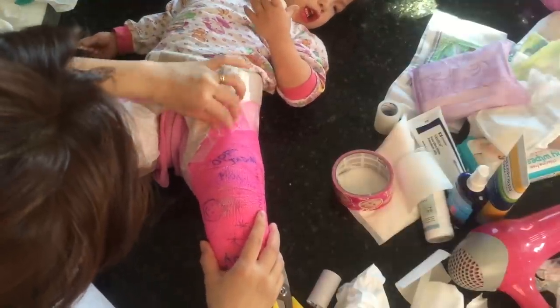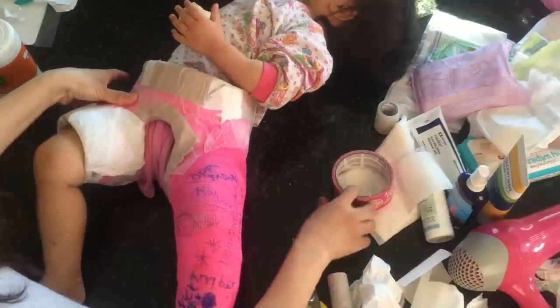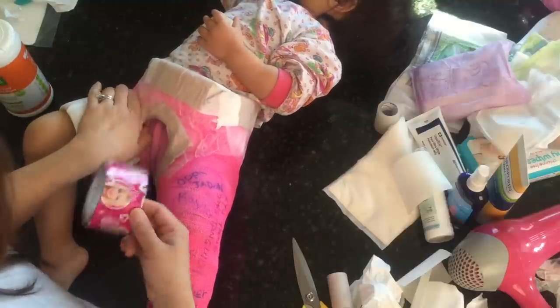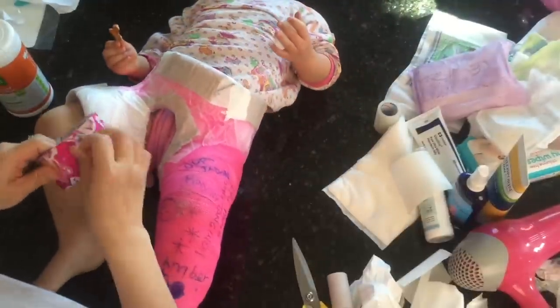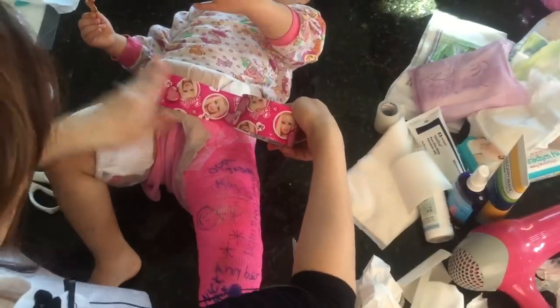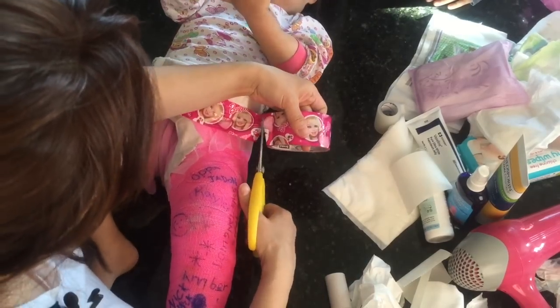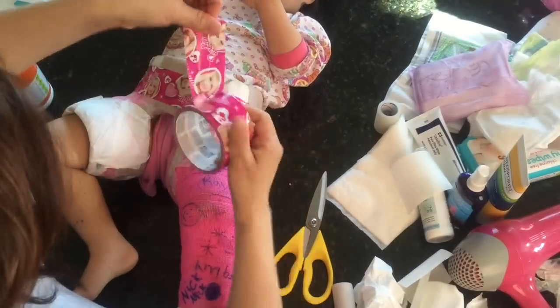Touch it with your hand to see if anything isn't sticking properly. The hospital tape doesn't stick super well on its own, so if she's sleeping and rubs it off it'll be a waste. That's where the duct tape comes in — get whatever design she likes, like Barbie or Frozen. Make sure the duct tape doesn't touch where her skin touches, but use it to seal wherever it needs to be.